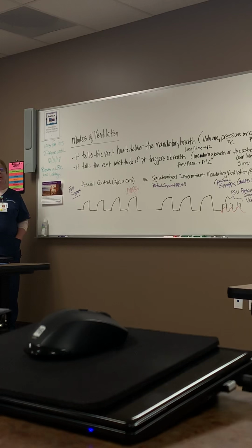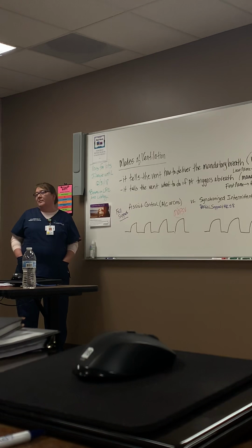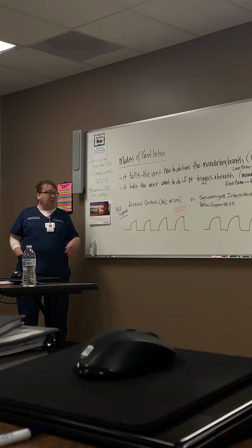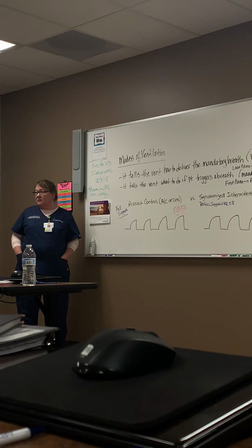Oh yeah, you can tell by the rate, because if you have a set rate of 12 and the rate's 18, you know my patient has to be doing some of them, because the machine rate is set at 12. Is there any other questions?